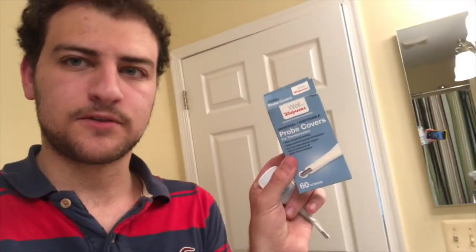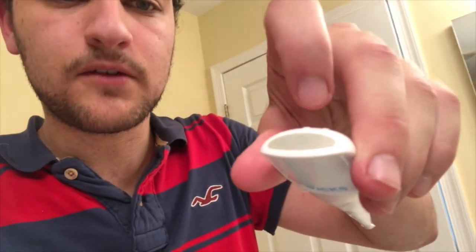I'm burning up right now and I feel like I have a low-grade fever, so we're gonna check it out. First you put a probe on it — we have them from Walgreens to protect from infections. Then you turn the VIX on by pressing the button, and you put it on your tongue. I'm gonna switch over to the app and show you my results.